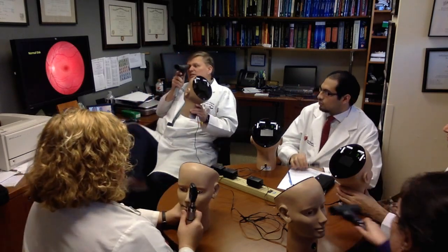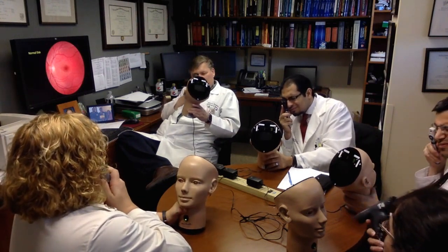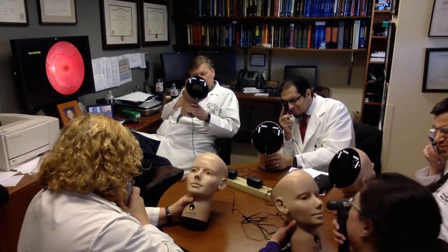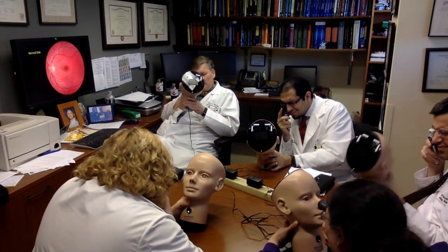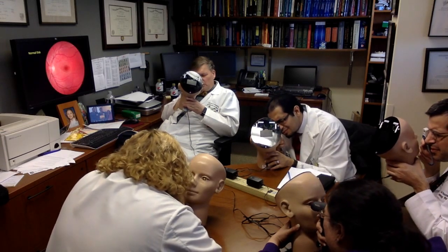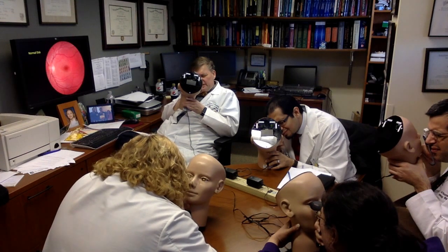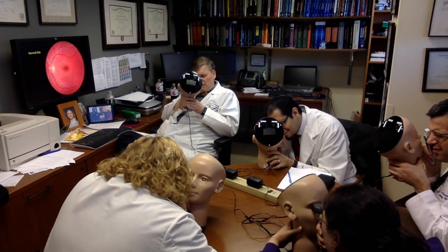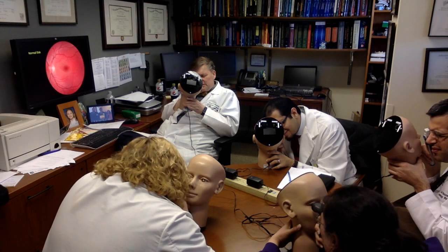So focus about 10 feet away. Make sure it's in focus for you. Then come in at about 15 degrees, see a red reflex or some orange or pink or red, come in, come in, get very close, then slowly turn your wheel one way or the other till it focuses in, and then get as close as possible. Then when you're there, you want to look at the disc.